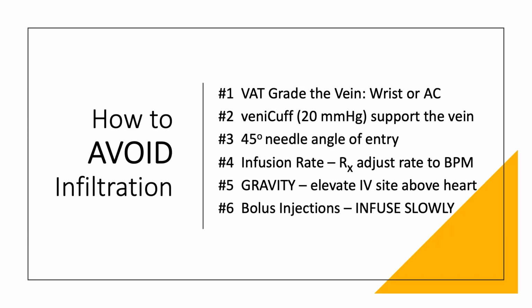The infusion rate, well, that's going to have to be dictated and adjusted by the doctor, but the concept is adjust it to the rate of the flow of blood. Next, gravity. Instead of that arm just sitting there sedentary, and you can't have them milk the hand for 24 hours a day for 3, 4, 5, 7 days for the length of the IV, then we're going to elevate that IV site to just above the level of the heart, whether they're sitting or they're laying, and let gravity bring blood back to the heart. And then the bolus injection of anything is always infuse slowly, never rapidly.